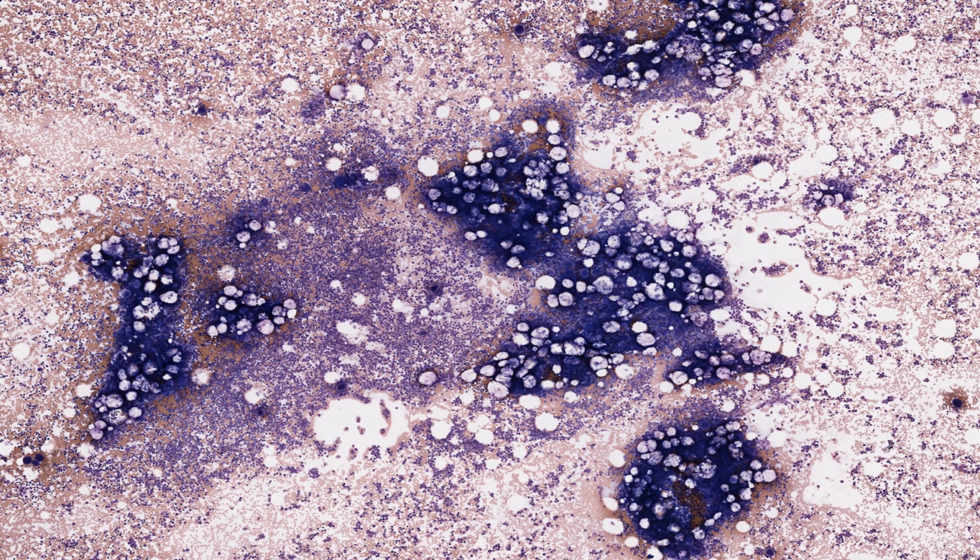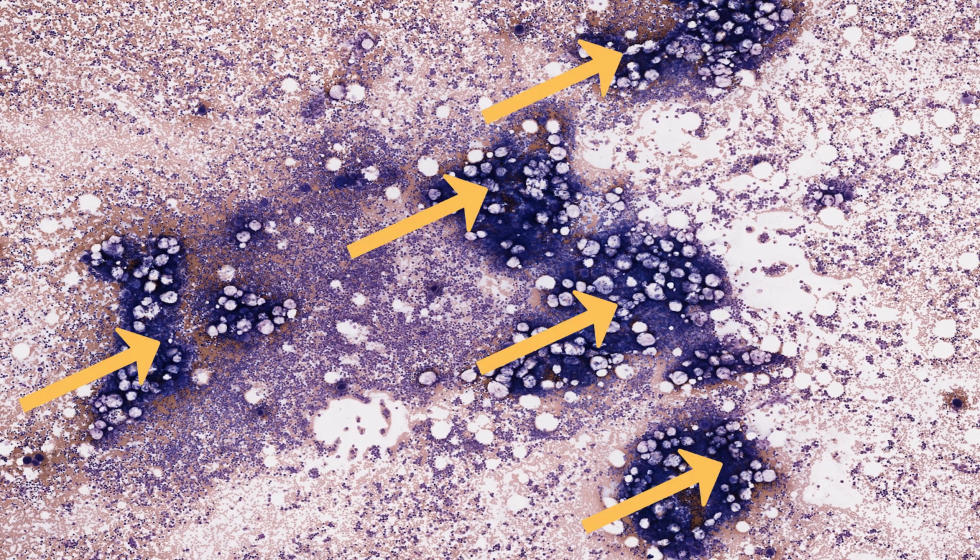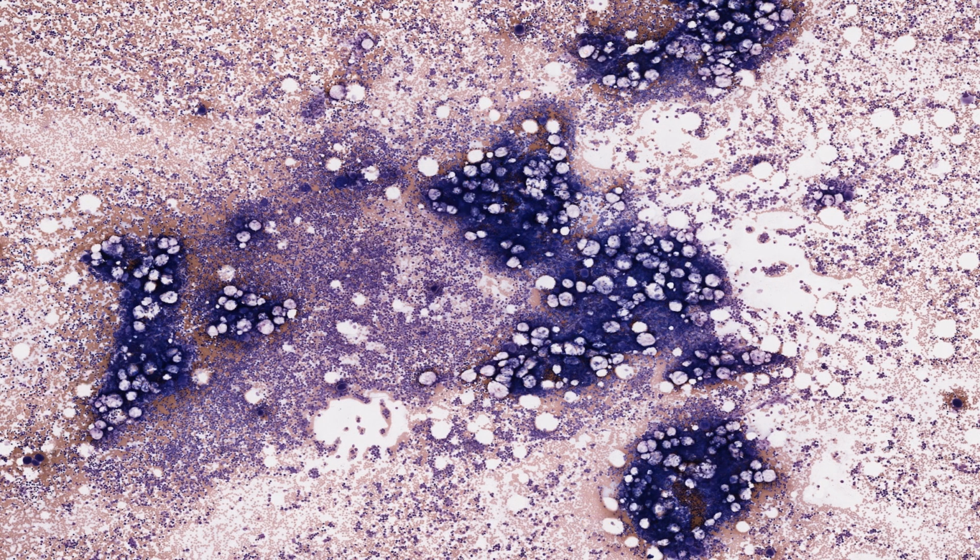So back to the details of this marrow smear. Note the several dark blobs. These are lumps of marrow tissue, too thick to study. And as I mentioned earlier, much of the rest of the smear far away from these lumps is covered mainly with blood, taken inadvertently with the marrow sample. I'm going to zoom in on cells in this area around the blue masses where they're closely packed.